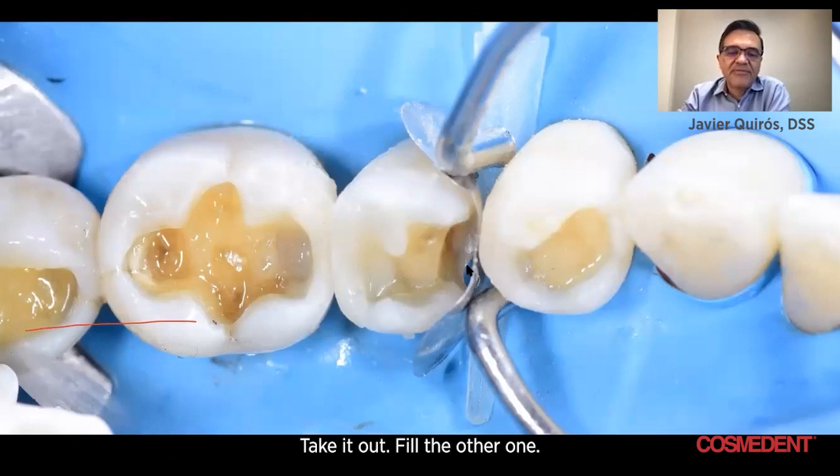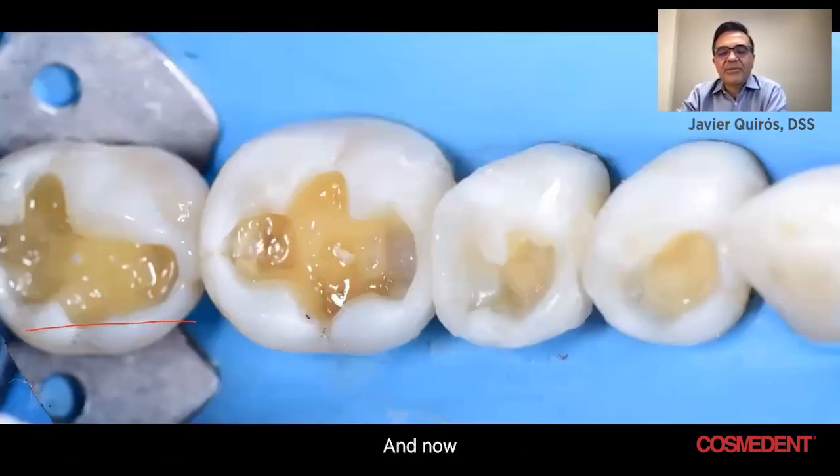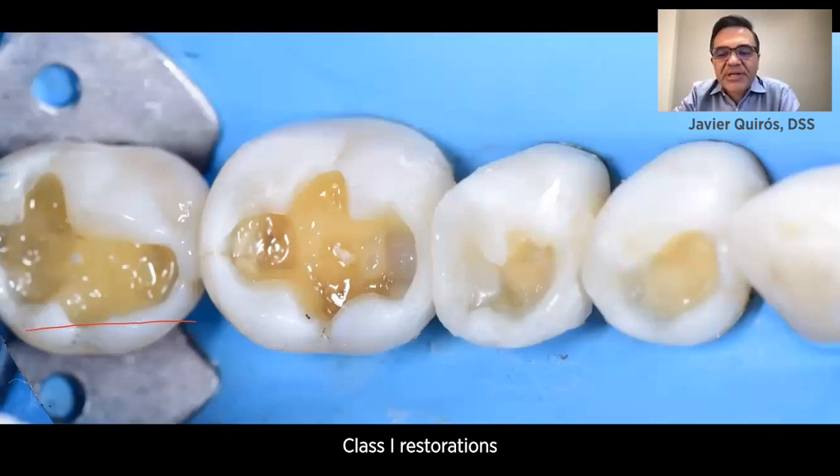Take it out, fill the other one, and now you have class one restorations that you can do very quickly. Thank you.